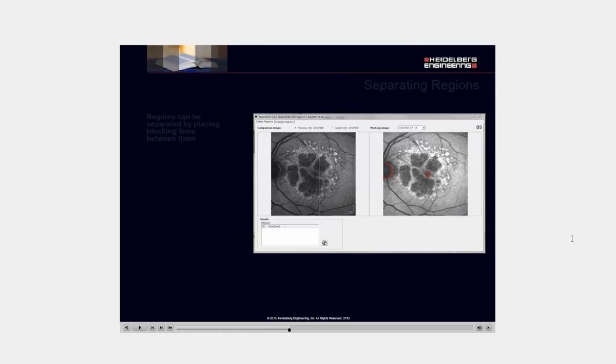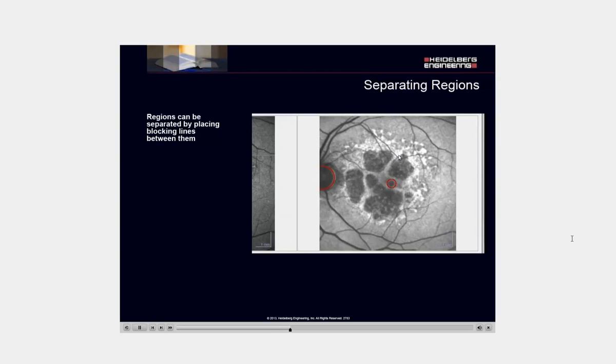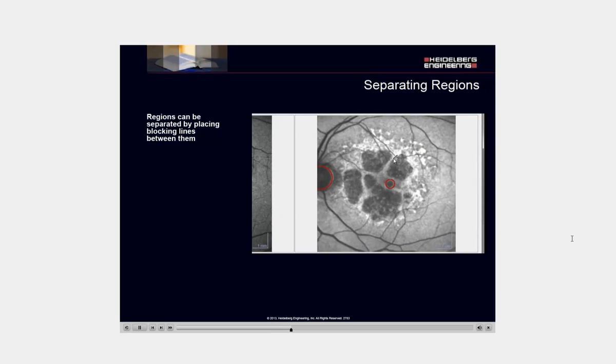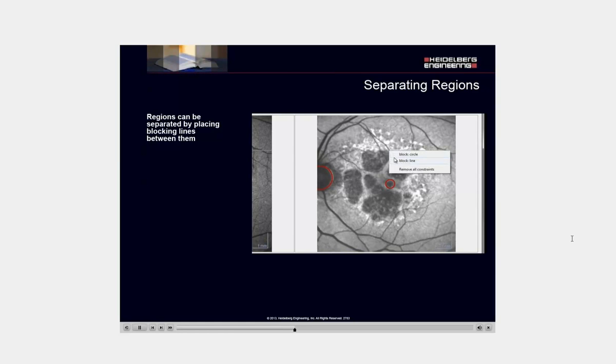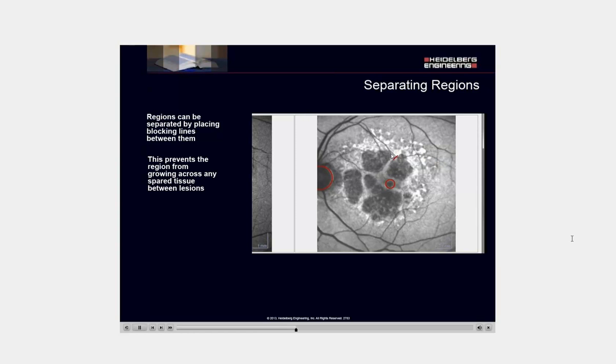The regions can be separated by placing blocking lines between them. This prevents the region from growing across any spare tissue between lesions.